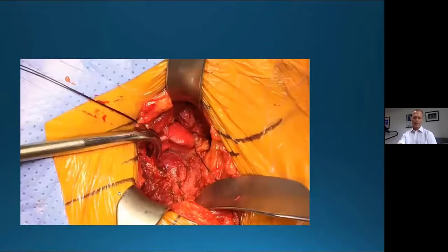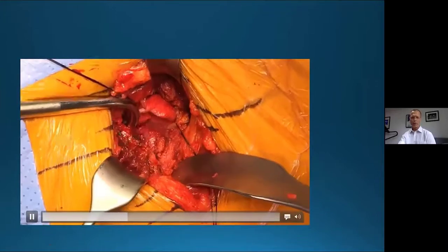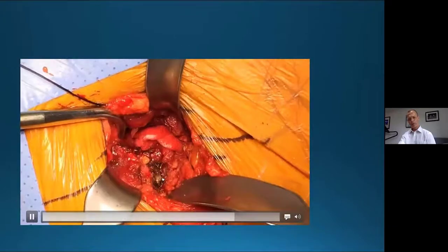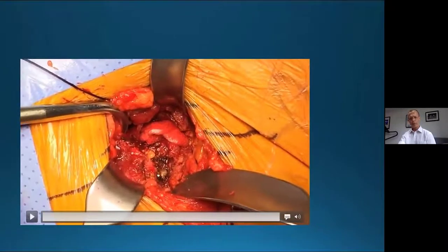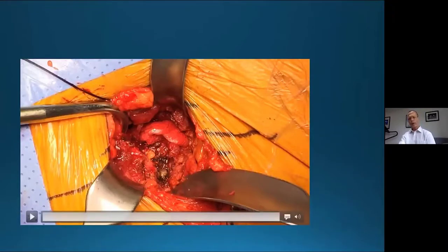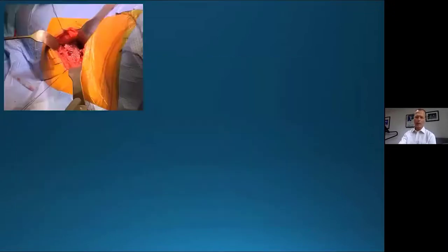This is the release that's really important to do. This is the proximal femur with the bone hook and the metaphysis. This is the capsular release on the inner surface of the greater trochanter. That's the release there in the acetabulum. So this is the key part of the operation. If you don't do this, then you really will struggle to get down the femur properly. I do that before I do the acetabular side, simply because you get a bit more mobility of the femur. It's easier to get it out of the way of the acetabulum for your acetabular reaming.